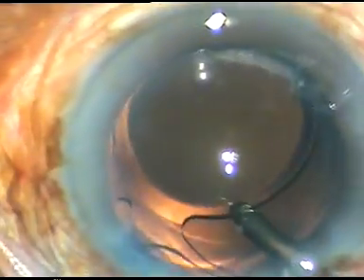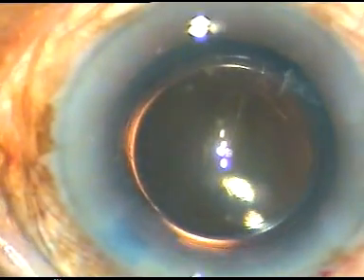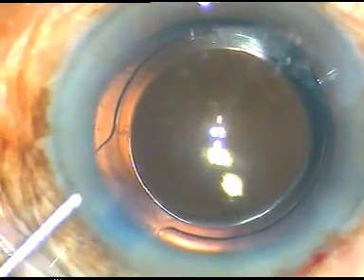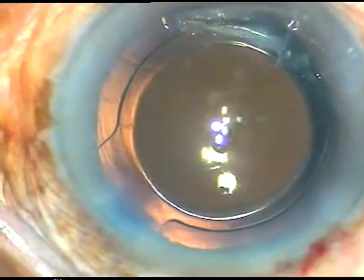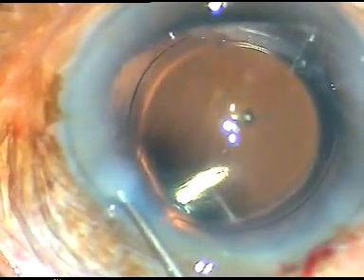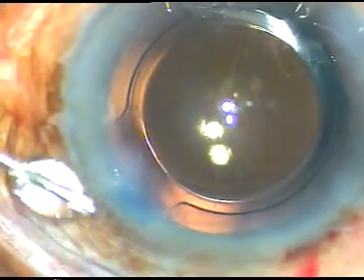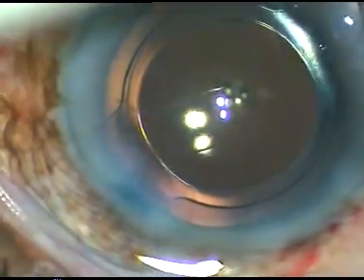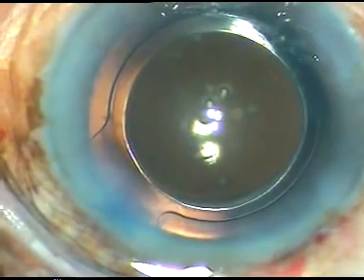And now the side ports are to be hydrated. Moxifloxacin has been injected into the anterior chamber just before this hydration. That's it.